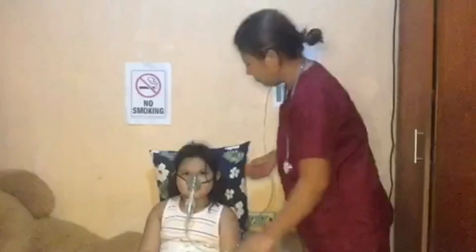Remove the mask and dry the skin every 2 to 3 hours while oxygen is running continuously. And lastly, do not use powder around the mask. Excuse me, Miss Anika, I will just remove the face mask.